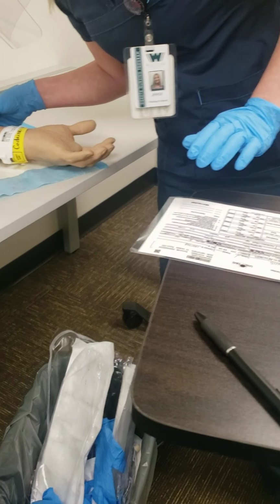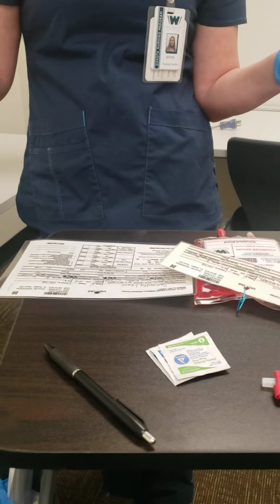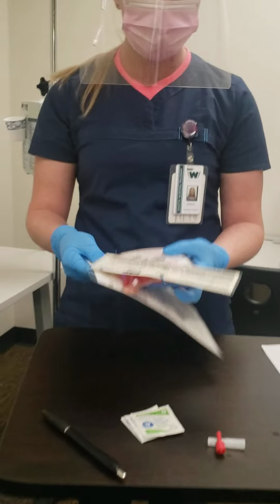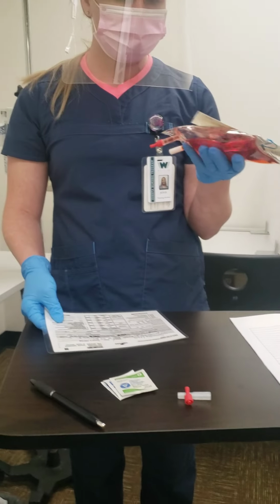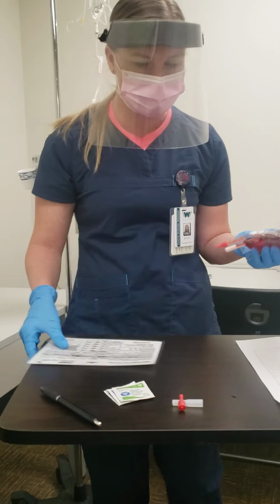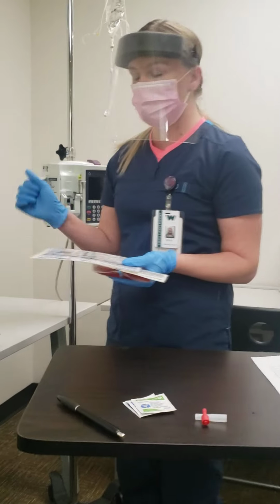accurate, and we have AFN 3889, which matches both of these. So the med tech has verified that with me, and now I will just take this to the client's room. Also, I just noted that the integrity of the blood is intact. It's not clotted or anything like that. So now I'm going to go into the client's room, knock, knock, knock.